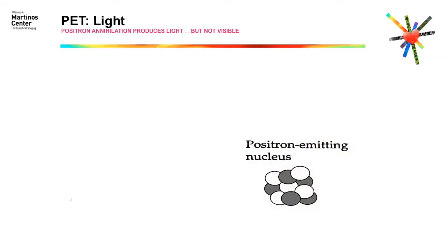Once we have the radiotracer, then we can inject it into the patient, and hopefully that tracer is going to be a biologically meaningful tracer. By that, I mean that it's targeting some of the processes of interest that we want to capture, yes? As I was saying before, we can capture some of the different receptors in the brain, dopamine, the opioid, the serotonin receptors, for instance, or we can make the tracers bind to the tau tangles, so tau proteins, or to the amyloid proteins. So we can actually target however we want.